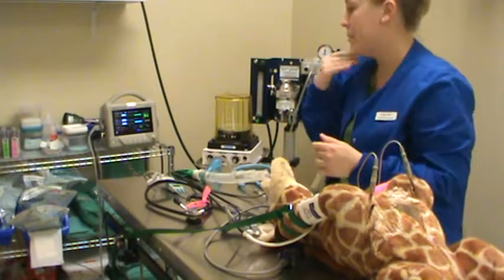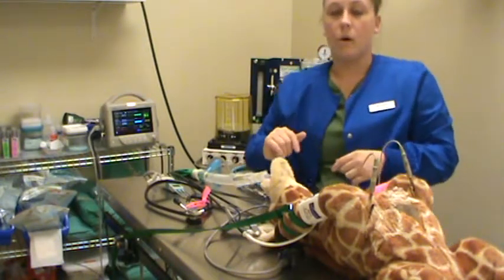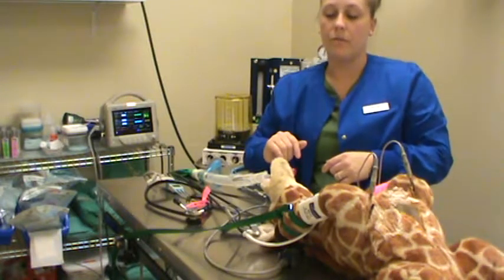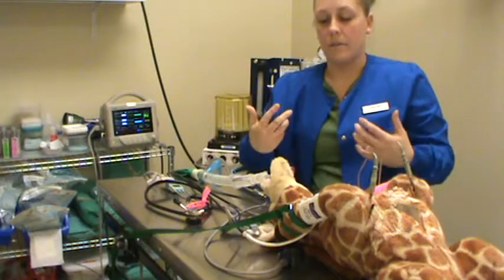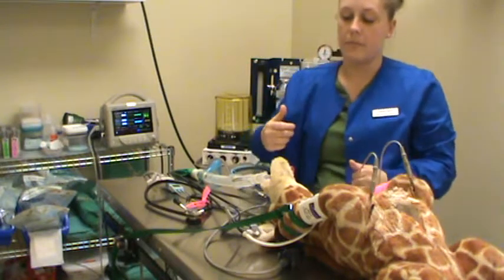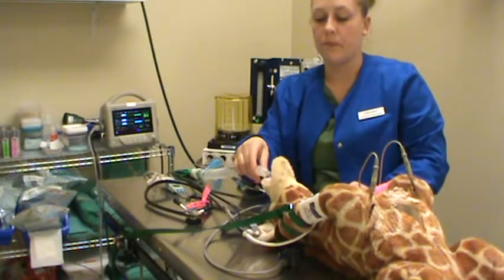So that measurement comes back over here. That is going to give us a really good idea of how well we're ventilating our patient, if we're ventilating them appropriately, if they're receiving the correct amount of oxygenation to keep them perfused. So we have to really watch this.